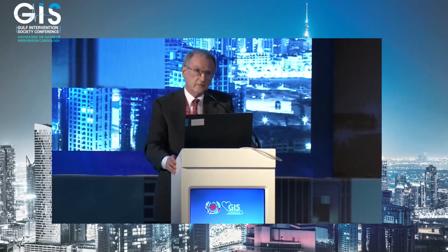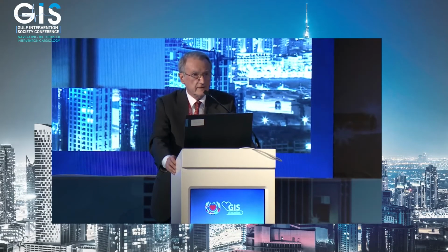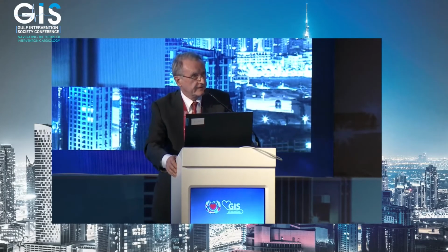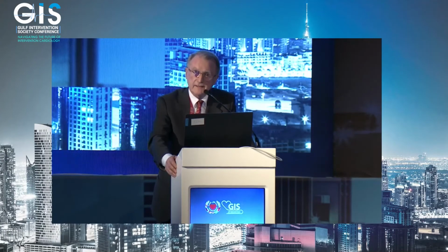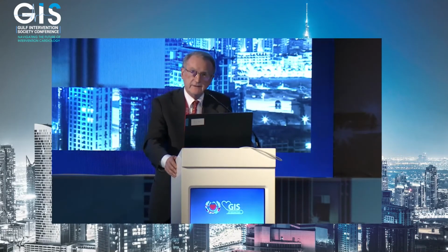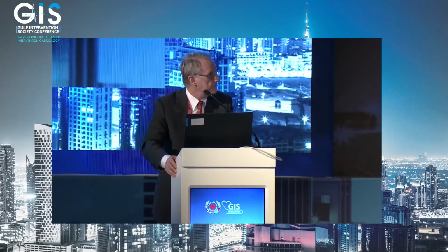I agree. I think a scoring balloon or cutting balloon can be very helpful in the setting of DCB usage. I don't know if we have to do a randomized study on every sentence we say, but I think scoring balloons are effective. They are a little bit expensive, so we don't use them routinely, but they are definitely an advantage. Antonio, do you think that we are in 2023?